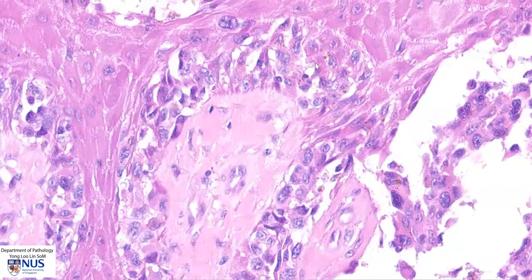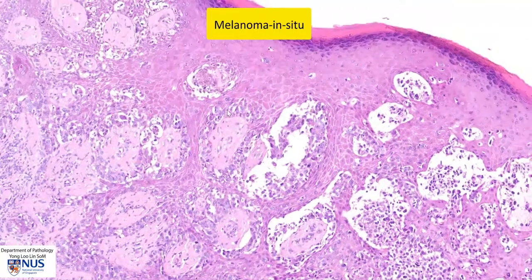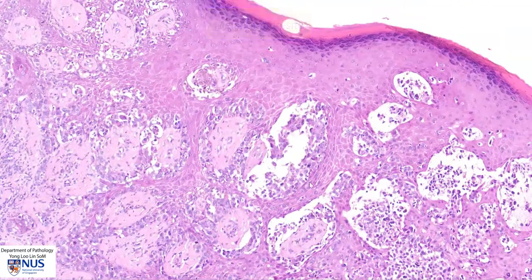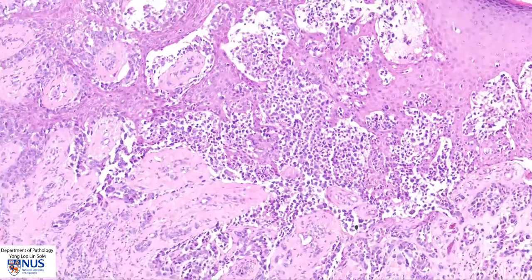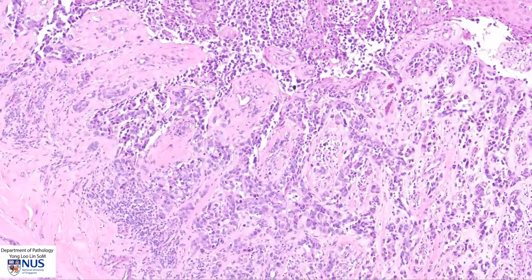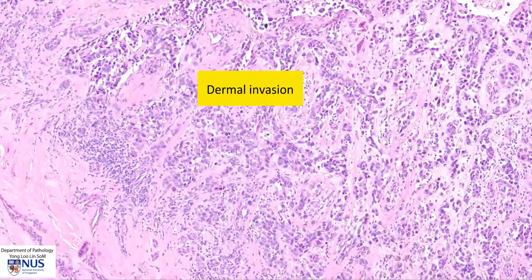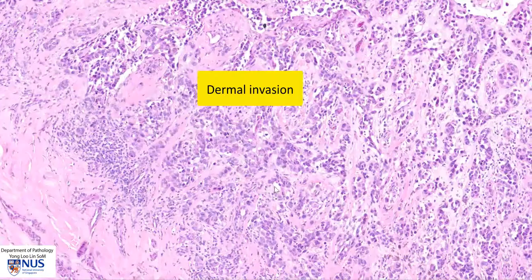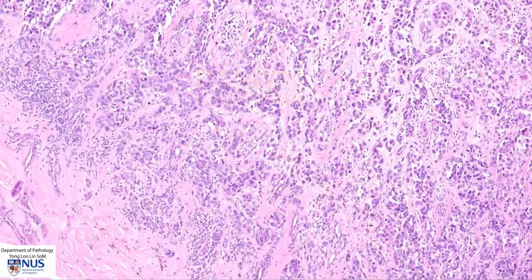These cells are part of the in situ component of the melanoma — so we have some in situ melanoma here. But over here we can see that the melanoma tumor cells are actually infiltrating downwards into the dermis.